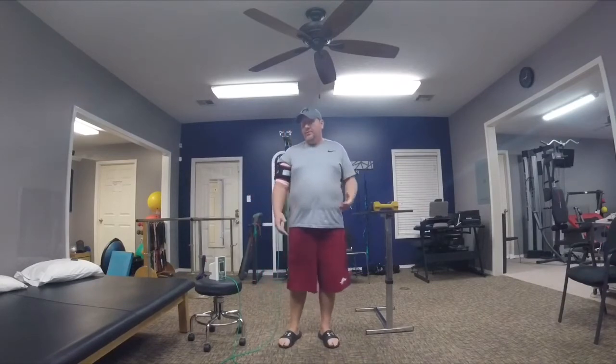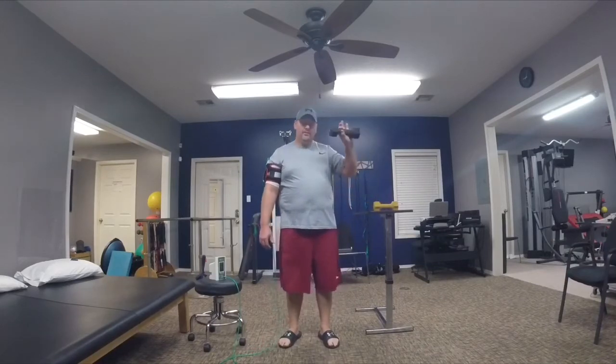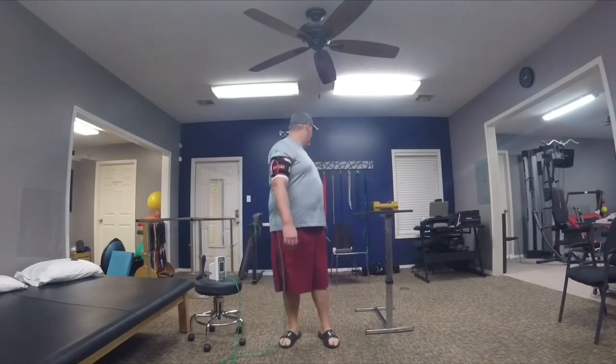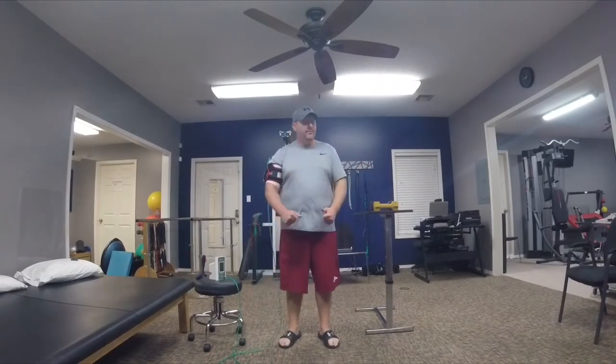So what I'm going to do is demonstrate how the BFR machine works. I've got a 10-pound dumbbell, an 8-pound dumbbell, and then I will do some curls with those, and then I will also go back here to the machine behind me with the green TheraBand and do some tricep push downs.